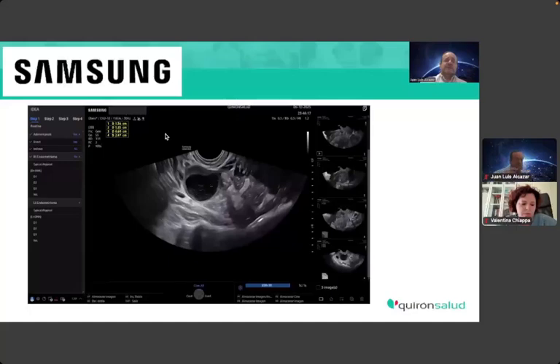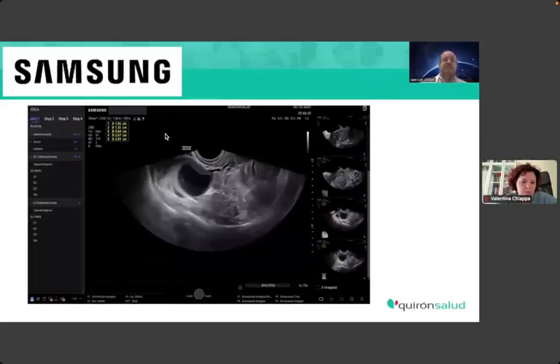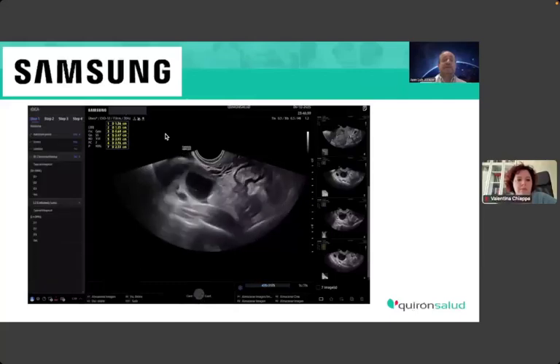In case you observe any endometrioma, you can establish whether this endometrioma is typical or atypical, and you can measure the size. Actually, you can calculate the volume of the endometrioma. Now measuring the hemorrhagic corpus luteum.